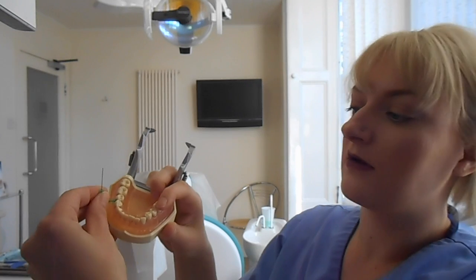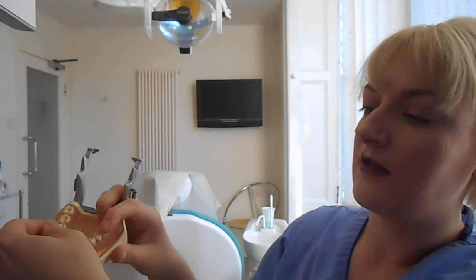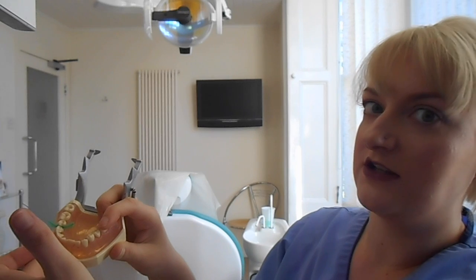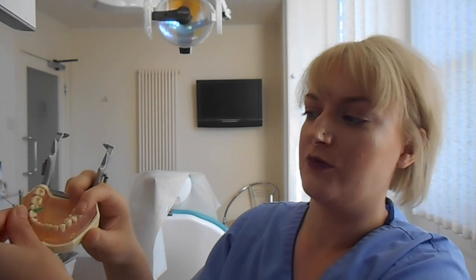So popping the brush in between your two teeth, push the brush through, and to get it out, using your thumb, grasp the brush, push down, push down, push down, and then the brush will slide out. If you don't use the brushes like this, and you try and use them in the way that you would use an interdental brush with a plastic handle, the straight ones, they won't go through. And if you try and pull the brush straight out without using the technique that I've just shown you, the brush will probably get stuck. Now don't be afraid if that happens, because if you push down on the brush, it will always come out. So if you use that sweeping action, it will always come out.